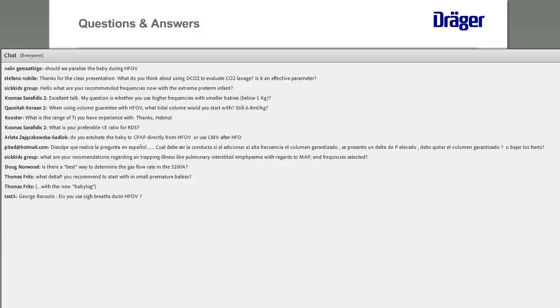Do you use sigh breaths during high frequency ventilation? Not now. In the late 80s there were some studies from the United States, and also from northern Europe, that recommended using a combination of tidal ventilation and high frequency at the same time.